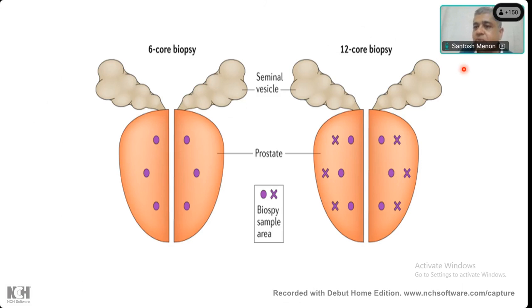So I think what we need to understand is that in a prostate, we generally don't have a very defined mass lesion. The second point is that prostate is a multifocal cancer. For that matter, even breasts are multifocal in many cases. But a dominant mass lesion is generally seen in a breast, whereas in a prostate you don't have very well-defined lesions. Over the years, the practice has been to take these multifocal biopsies or template biopsies in the prostate.